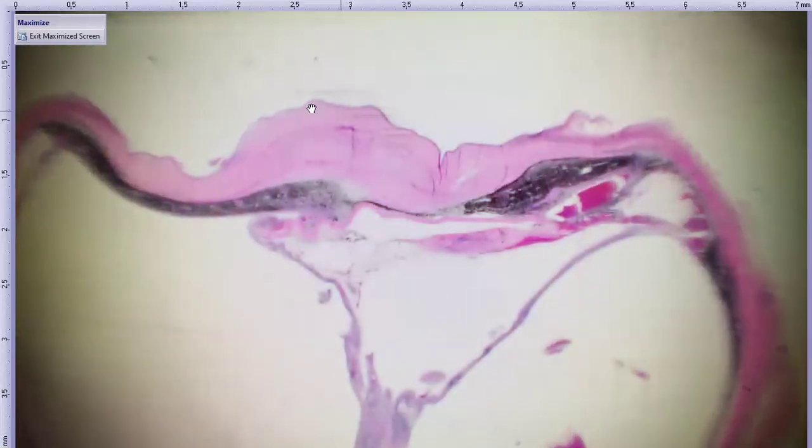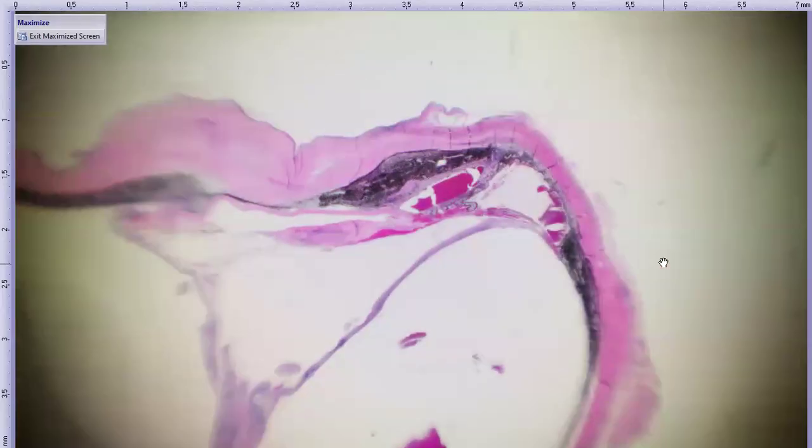All right, so there is our cornea. Here's that off-white material I mentioned in the anterior chamber. Here's the iris. It's actually kind of thick and fairly heavily pigmented. This is a boxer, so we should always consider uveal pigmentation issues in boxers, mostly uveal melanosis versus just simply a heavily pigmented uvea. And you can see that the ciliary body is also fairly heavily pigmented there.